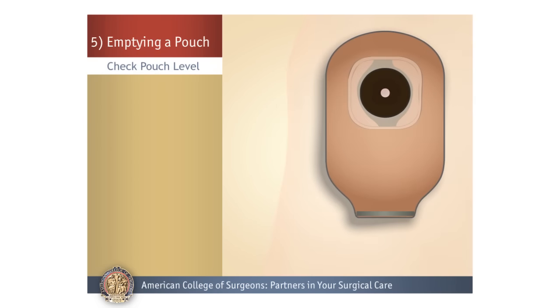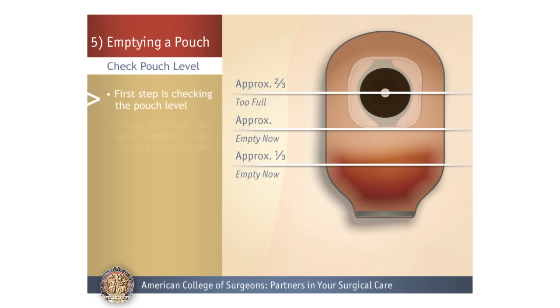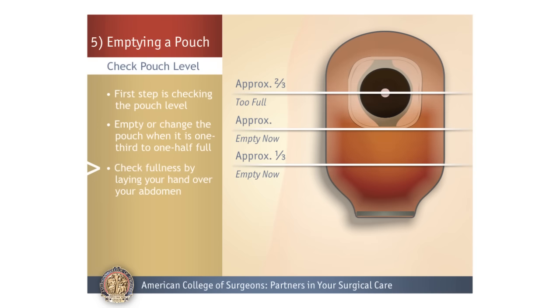Check pouch level. The first step is checking the pouch level. Empty or change the pouch when it is one-third to one-half full. A pouch that is too full may start to pull away from your skin because of its weight. You can check the fullness of the pouch by laying your hand over your abdomen. Empty the pouch on a regular schedule.